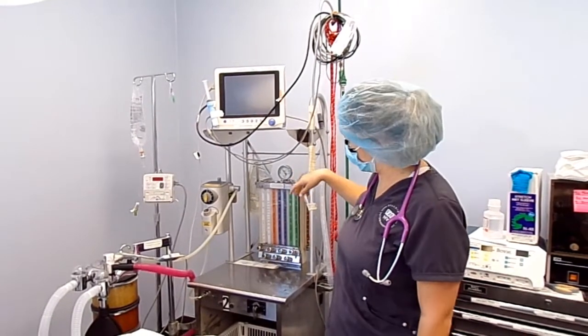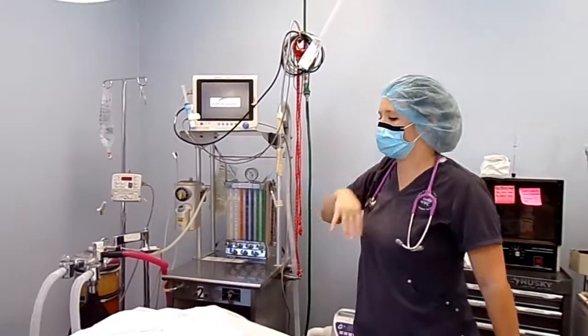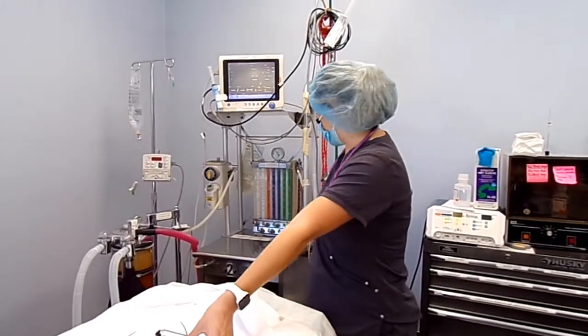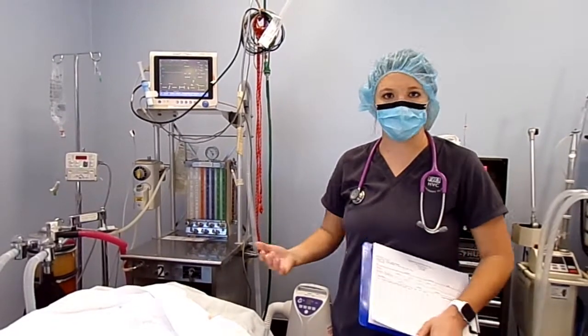We have our fluids over here and our fluid monitoring. We'll hook the patient up on IV fluids throughout the whole entire procedure. We like to set up everything before we ever bring our patients in — make sure we're ready to go.